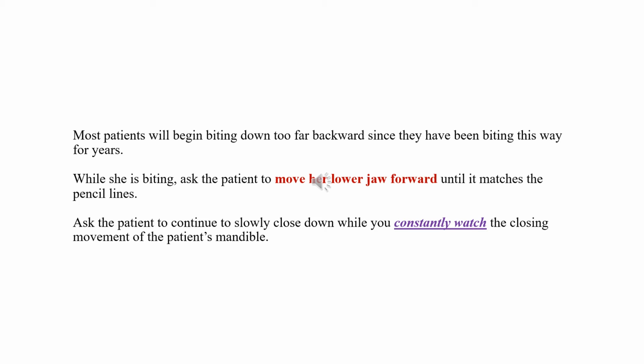So you're going to have to be aware of what's going on all the time, watch where the patient's biting, talk to the patient, caution the patient, and let the patient know that as soon as you feel something to bite in, you're going to want to bite backward because that's what you've been doing. So please resist this urge.